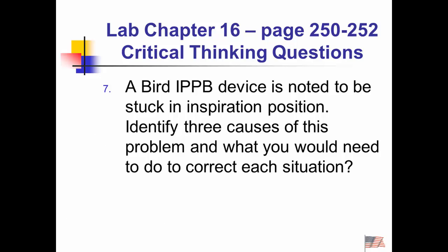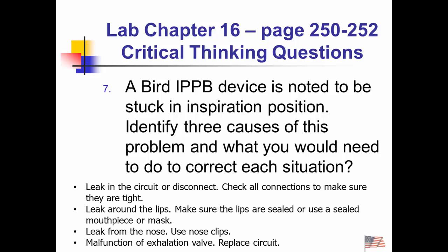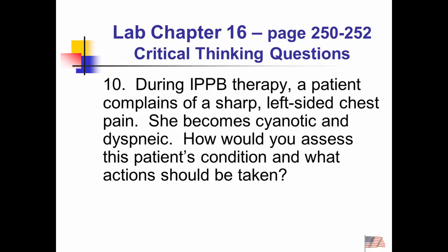A Bird is noted to be stuck in the inspiratory position. 3 causes of the problem. Well, I said leak. Leak, leak, leak. Leak in the circuitry, leak at the patient connection, or through their nose, or I got an exhalation valve that needs to be replaced, that's damaged. And as I go through the demo of it, you'll see what I'm talking about.